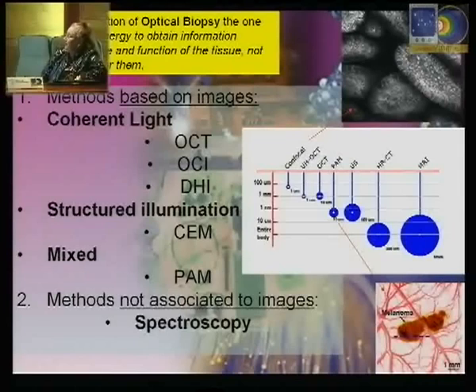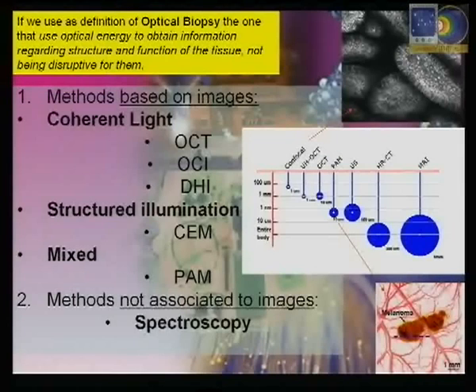First of all, we have to agree on the definition of optical biopsy. There are two types of optical biopsies. Initially, the term optical biopsy has been applied for spectroscopy. So nothing related with images.